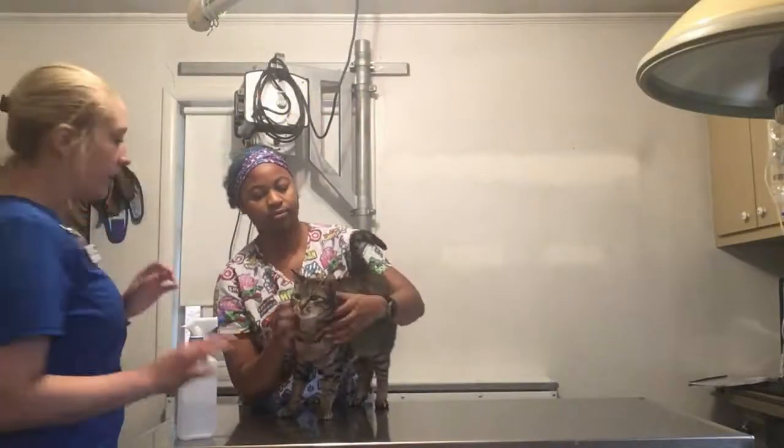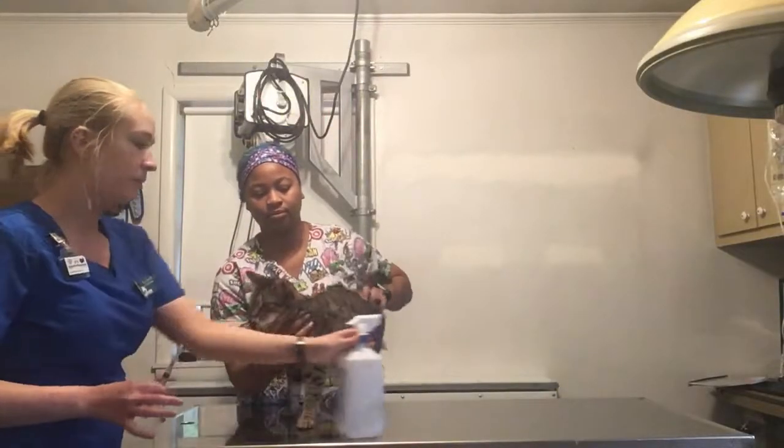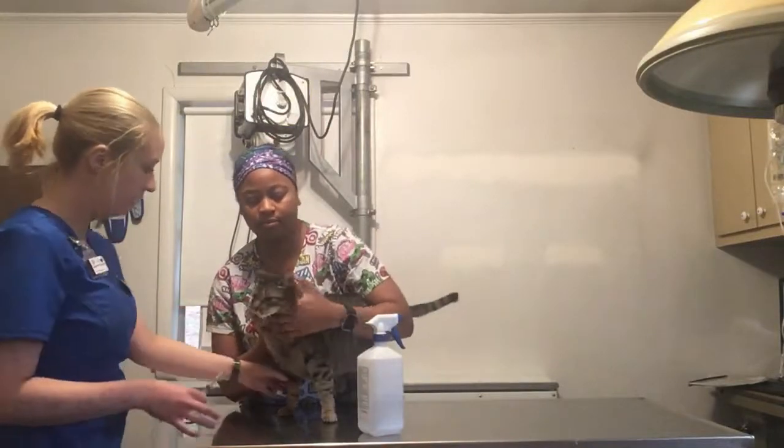Okay, we're going to be doing a blood draw from the cephalic of Miss Ruby here.